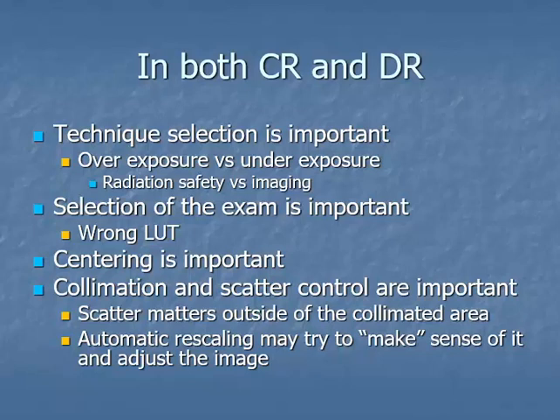Once we made the change to DR system, DR is much more similar in sensitivity to screens and films than what CR was. So our techniques in DR are more similar to our screens and films, with this one difference. When we made the change from screens and films to CR, what we had was an ability to change our technique and adjust our technique in a non-traditional way.